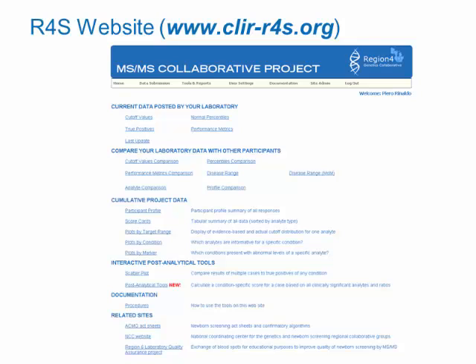The home page design of this and of other applications that will be mentioned later in the series is kept constant and is fairly simple to use. From a content perspective, there are 3 major clusters of components. On the top, users can find links to descriptive reports of all the data posted by the site they are affiliated with. In the next section, highlighted in the slide as peer comparison, a user can compare the data mentioned above with those of approximately 180 other programs worldwide.